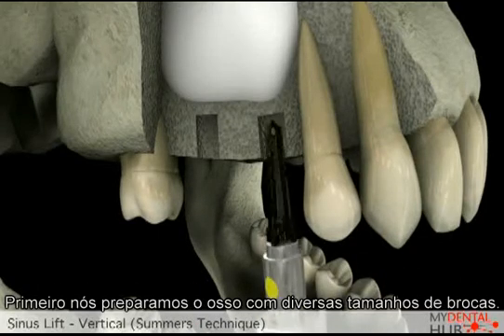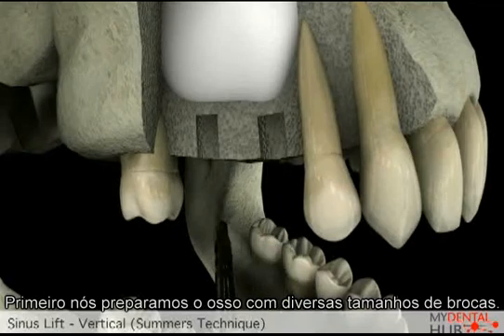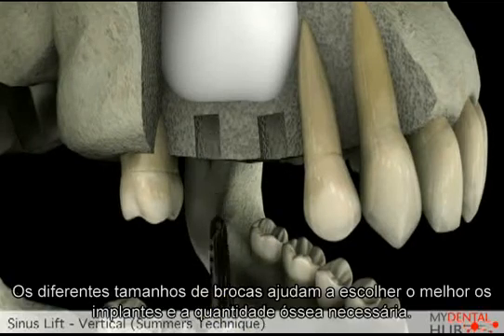We first prepare the bone using several sizes of dental drills. The different sizes of drills help us to get the correct length and widen the bone for the size of implant we are using.